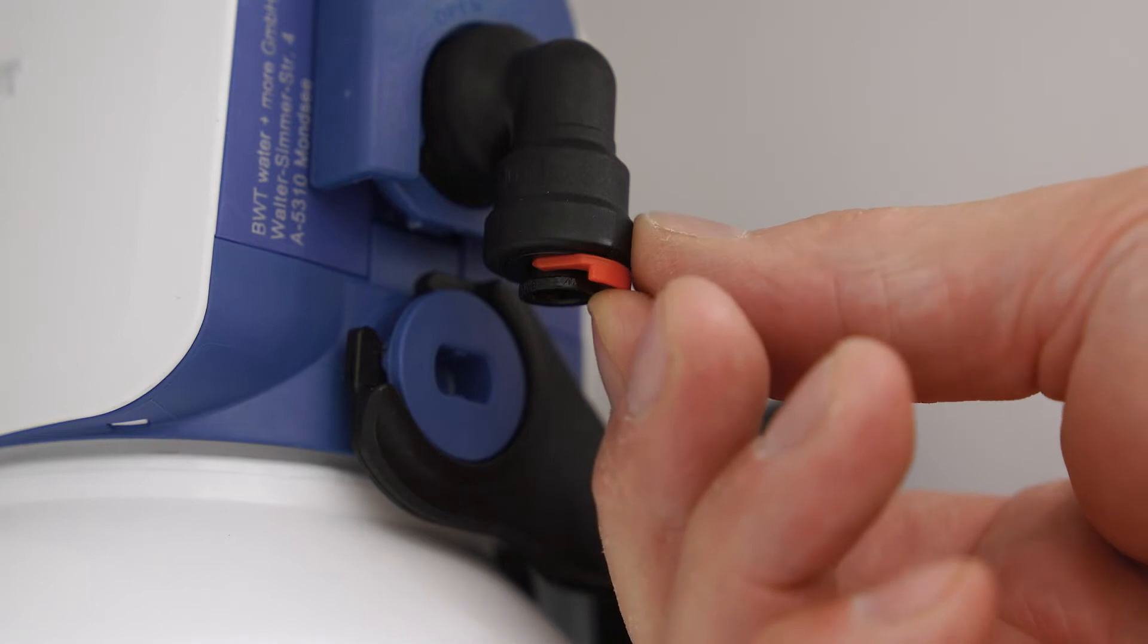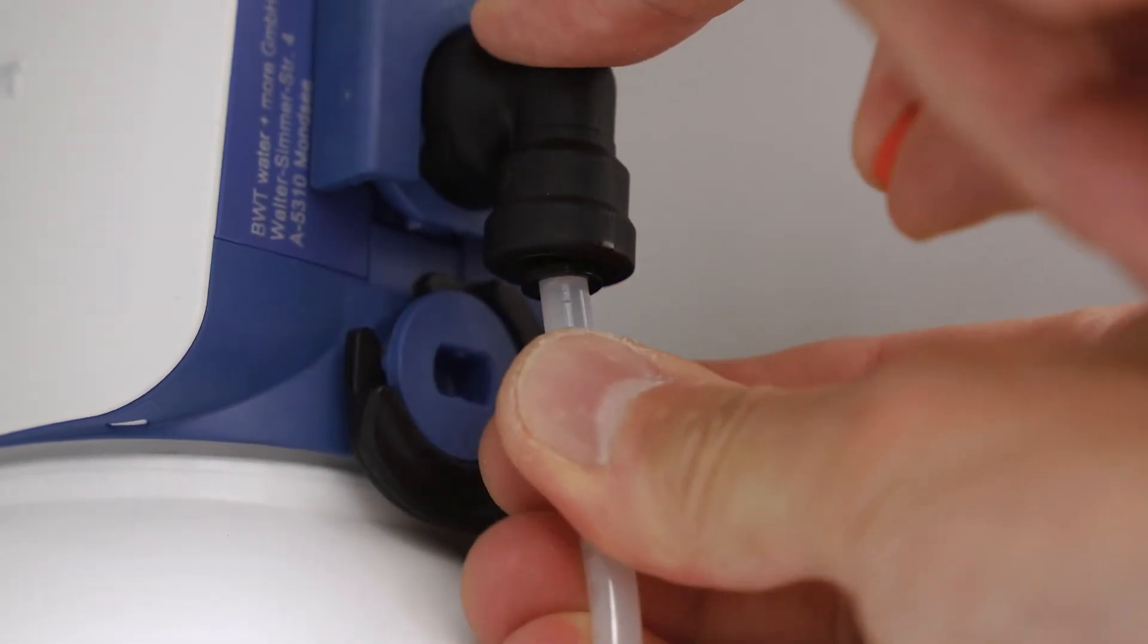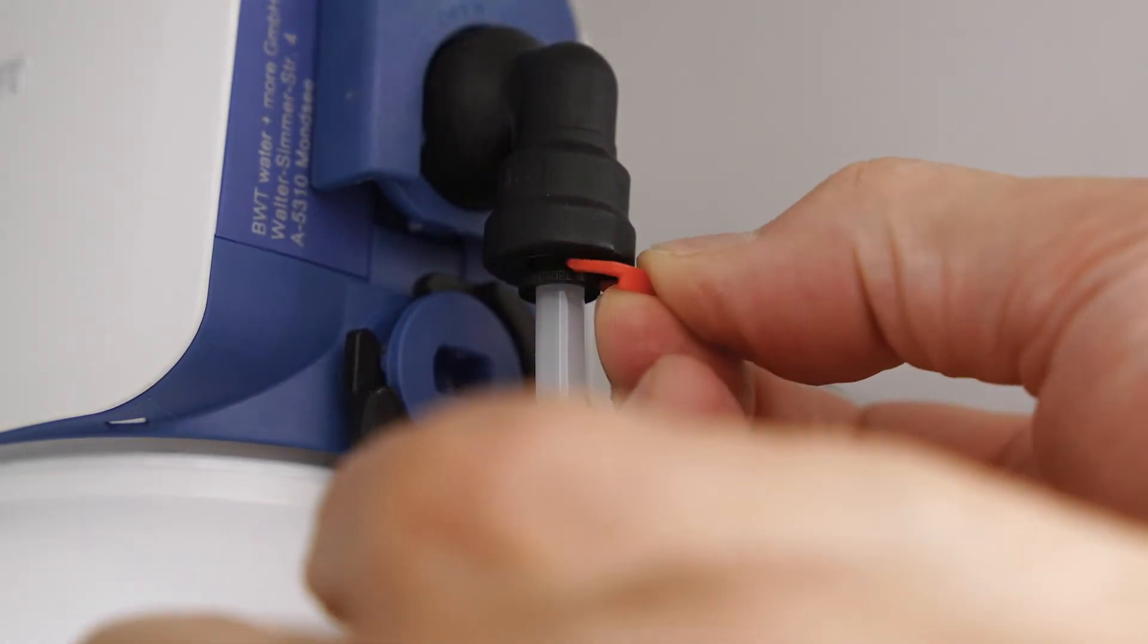Remove the red safety clip at the push-in elbow and insert the autoclave connection hose. Remember to remount the red safety clip at the push-in elbow.